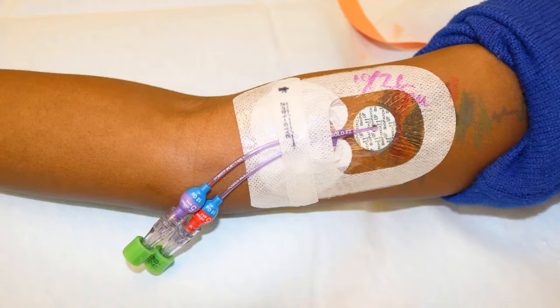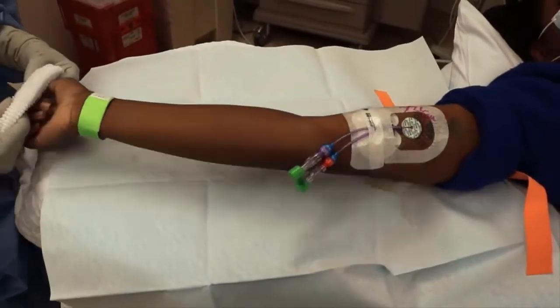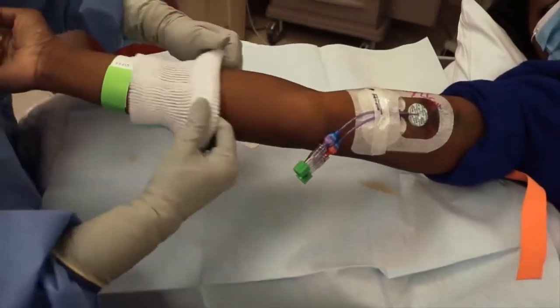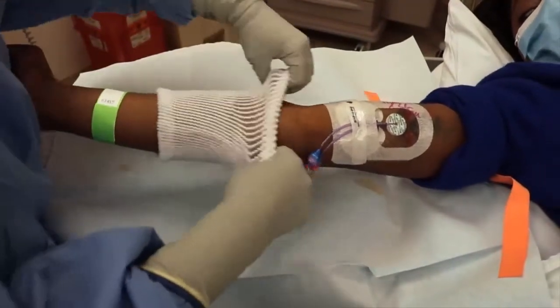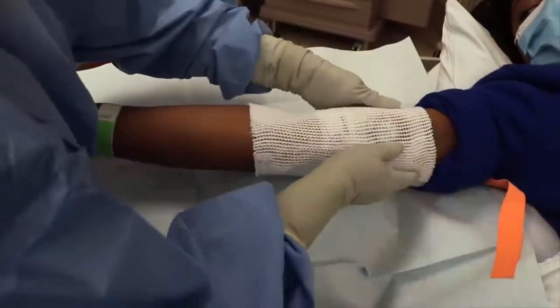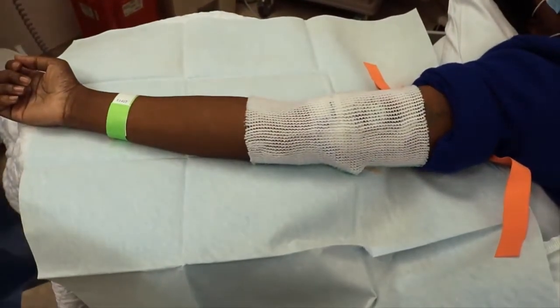Your PICC can be left in place for several months or longer if needed. Care of your PICC at home will need to be arranged. Care can be done through home health, your local oncologist, or through one of the Moffitt infusion centers or blood draw areas. Please discuss your at-home needs with your nurse or doctor.